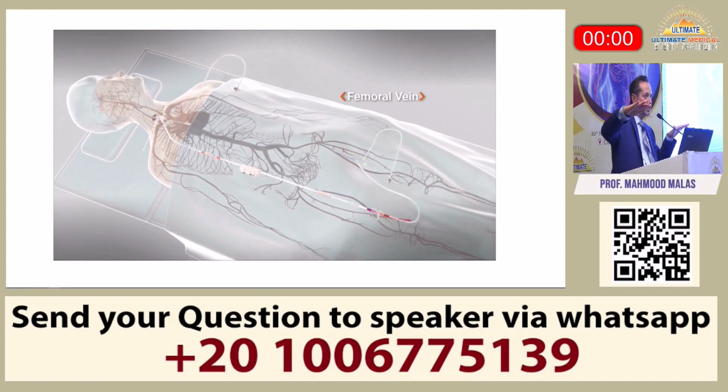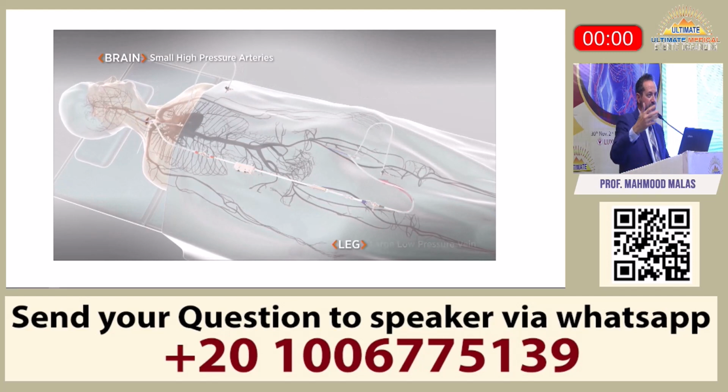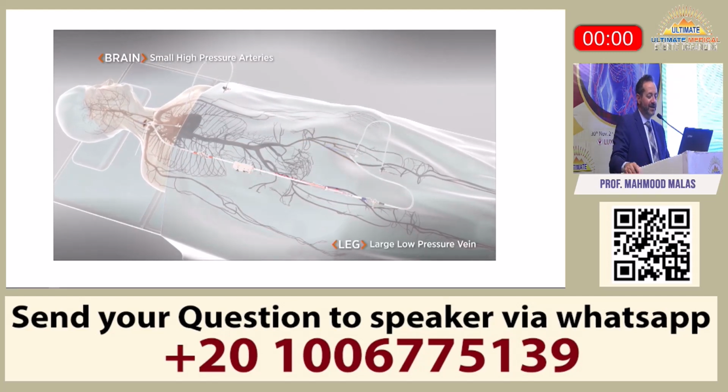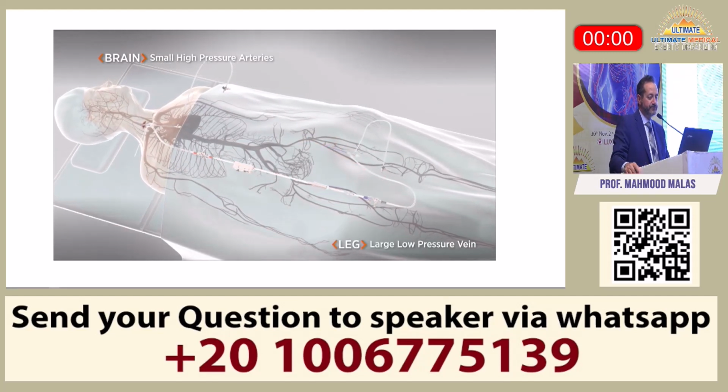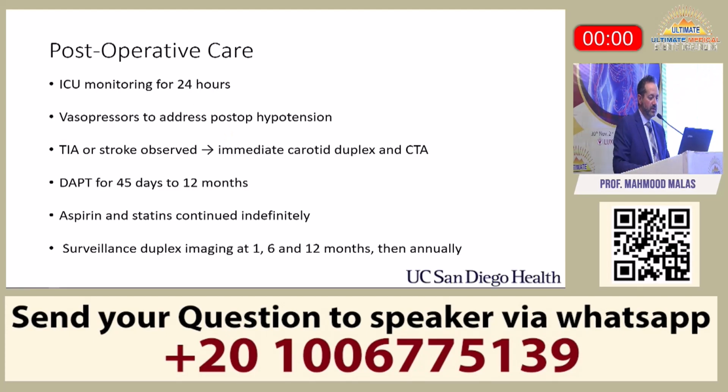I like to put it on the contralateral side because it's just more ergonomic the way it sits. You told me, Munir, it's not going to work. I didn't listen to you. But essentially, you have a flow reversal. And this is how this whole concept works.